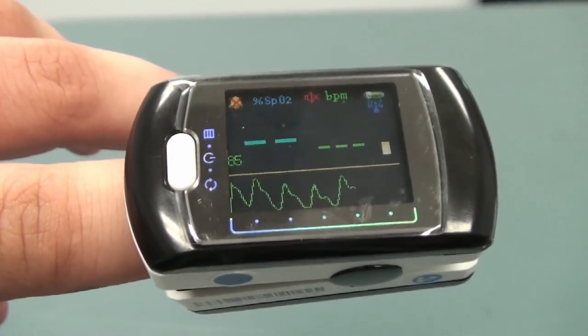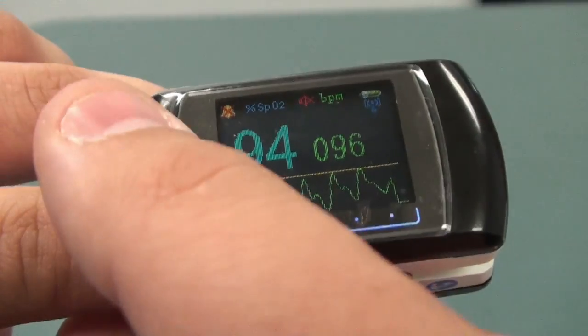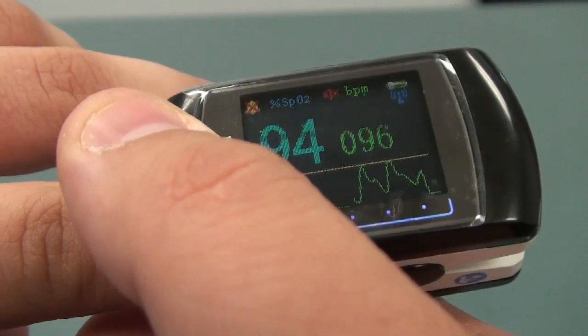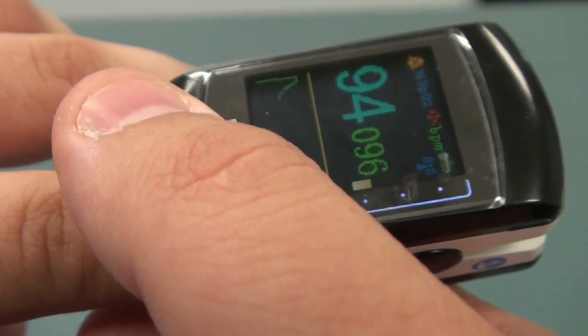The readings will start to show. If you're not happy with this view, you're able to change the view by pressing the power button to alternate the direction that it shows.